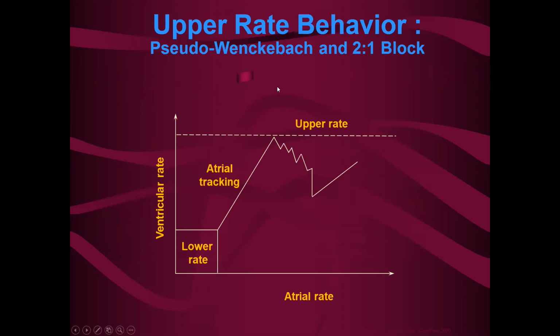And then I mentioned that there is also an additional interval in a dual chamber pacemaker that's called the upper rate interval. It's also called the maximum tracking rate interval. This upper rate defines the heart rate at which the pacemaker is still allowed to maintain the one-to-one AV relationship. So, for example, if I have a pacemaker that's set at DDD 60 with a max track rate of 180 beats per minute, that means the one-to-one AV relationship will be maintained only up to 180 beats per minute. So that's this upper rate interval here.